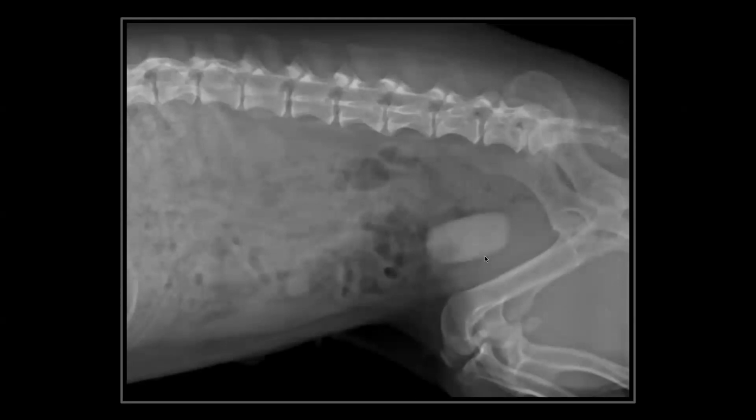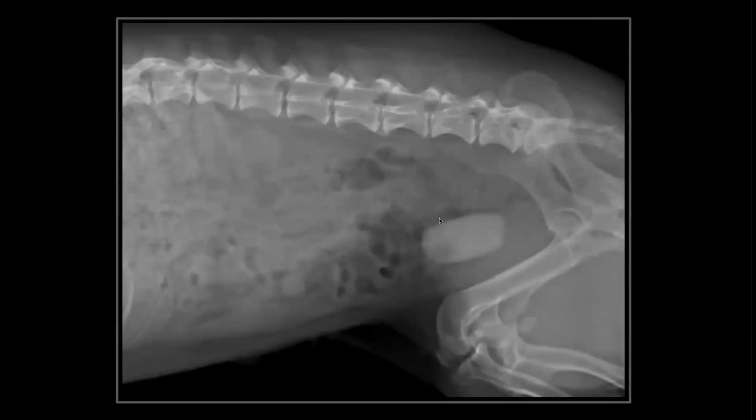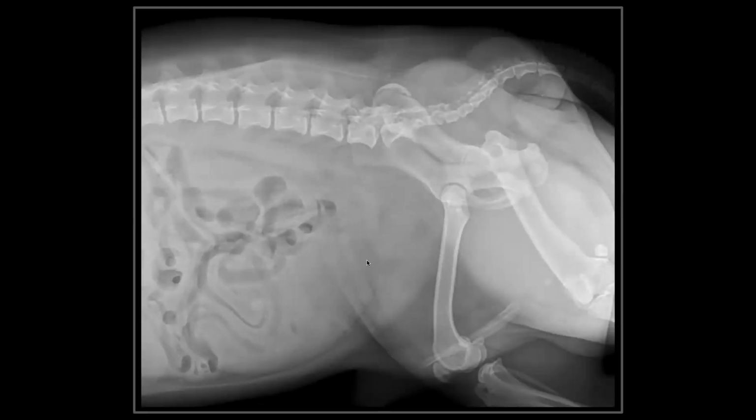Another bladder stone, obvious, but even when they're not obvious, we'll pick them up. And again, here are some stones, probably not calcium in origin, but could be. This bladder looks pretty distended. Again, the system continuously gets better. Right now, we're picking up bladder stones for our own purposes. We're not releasing the information until everybody gets comfortable with the system.